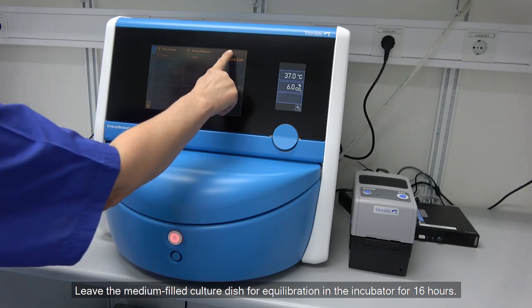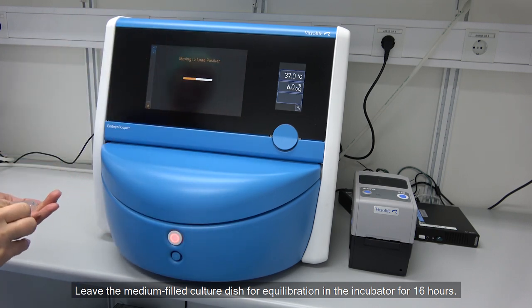Leave the media-filled culture dish for equilibration in the incubator for 16 hours.